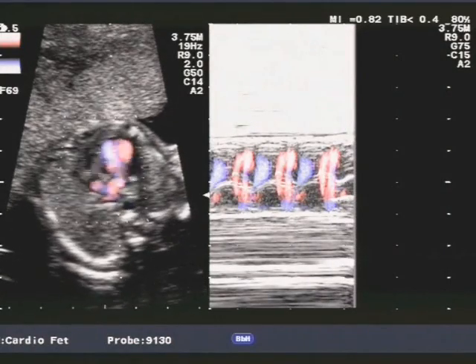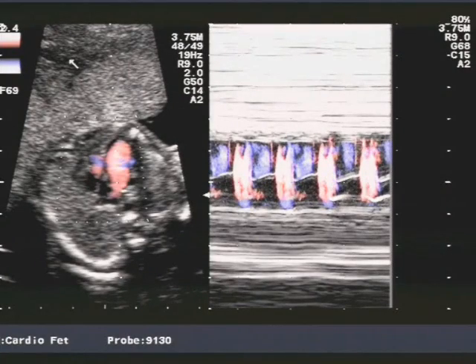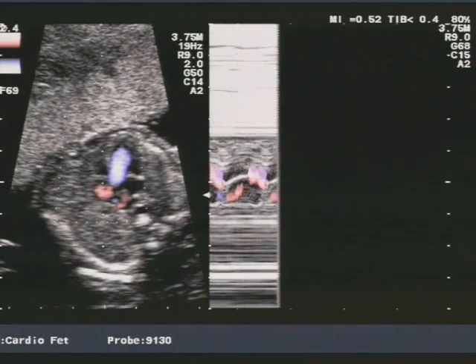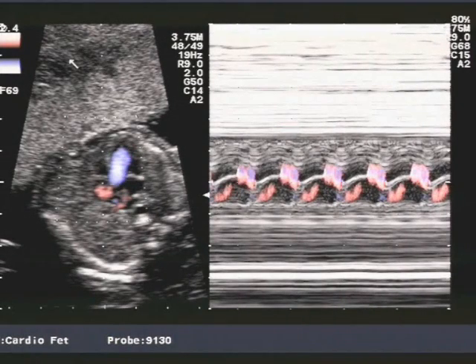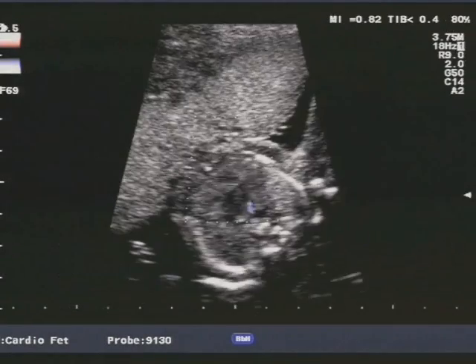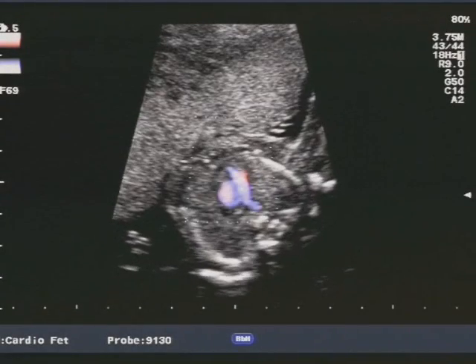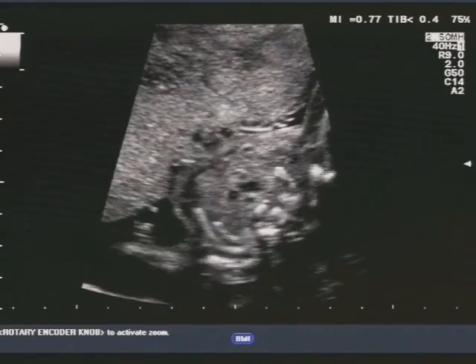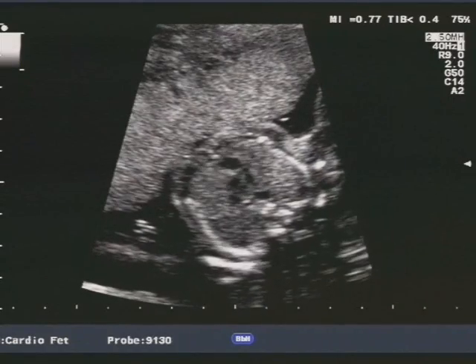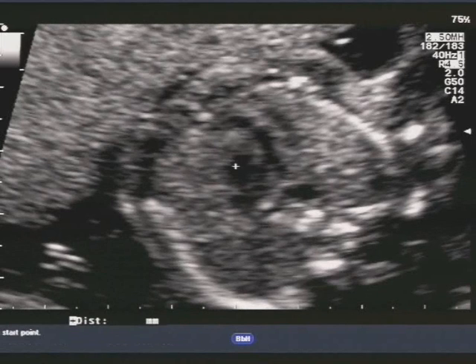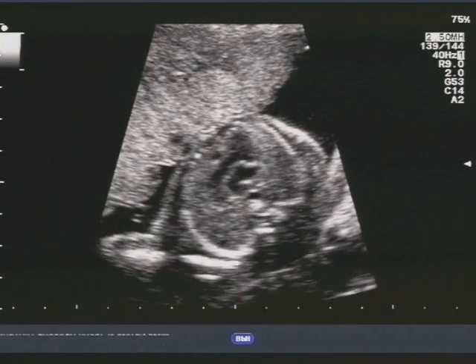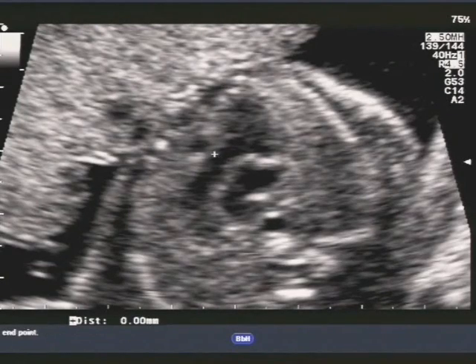Qui vedete che abbiamo una velocità massima che è intorno ai 90 cm al secondo, quindi sicuramente ai limiti alti, ma non suggestiva di patologia valvolare in senso stretto. Avete visto con l'aiuto del colore come la differenza tra la porzione destra e la porzione sinistra ventricolare sia decisamente importante. La mitrale è perfettamente continente, la tricuspide è perfettamente continente. Ed ecco che cominciano a sorgere dei dubbi in merito alla possibile diagnosi differenziale.